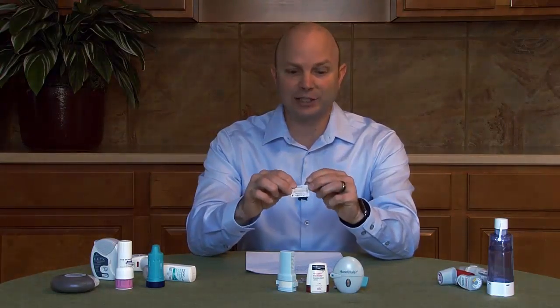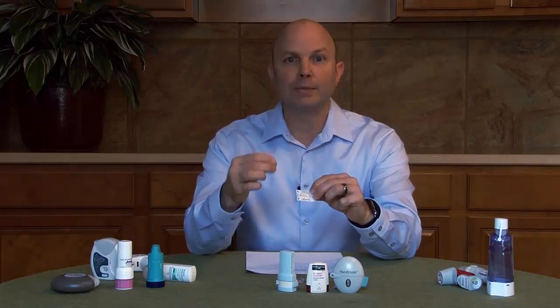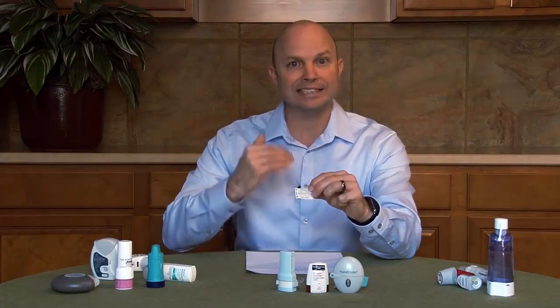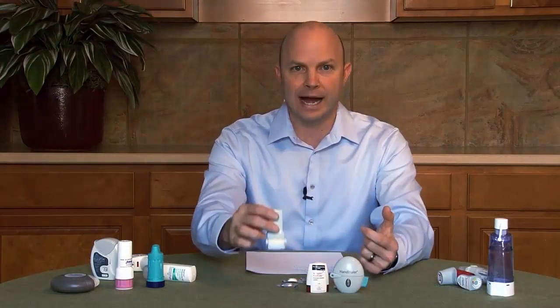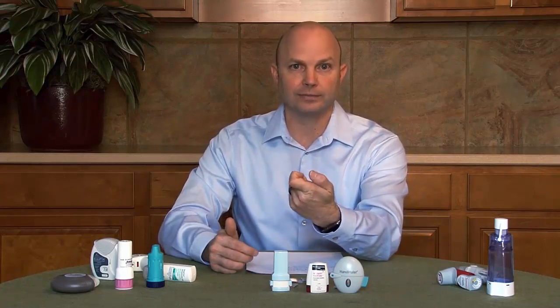The breathing technique with all of these dry powdered inhalers is a fast, deep breath. Remember, it's a powder that you need to inhale inside your lungs, so it requires a fast, deep breath. The other important note is when you use the piercing device, you only press it one time. If you press it multiple times, you'll actually cause some of the fragments of the plastic capsule to become dislodged, and you might inhale that into your lungs. So only pierce the capsule once.